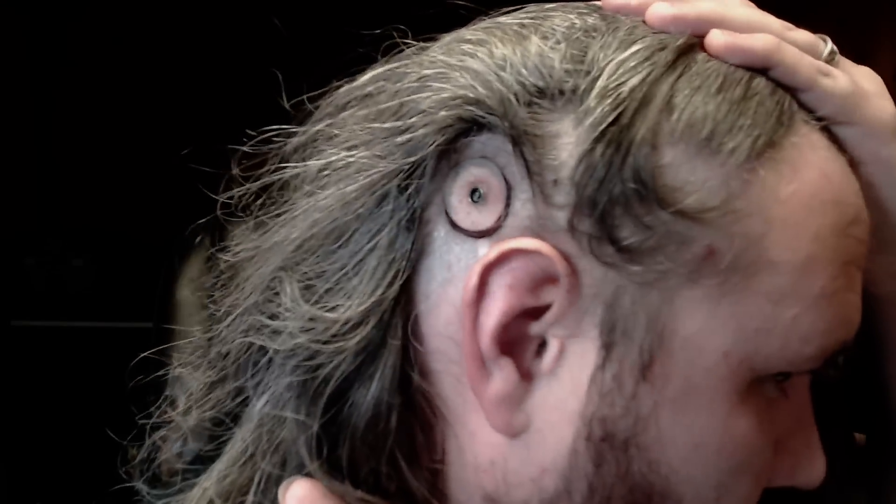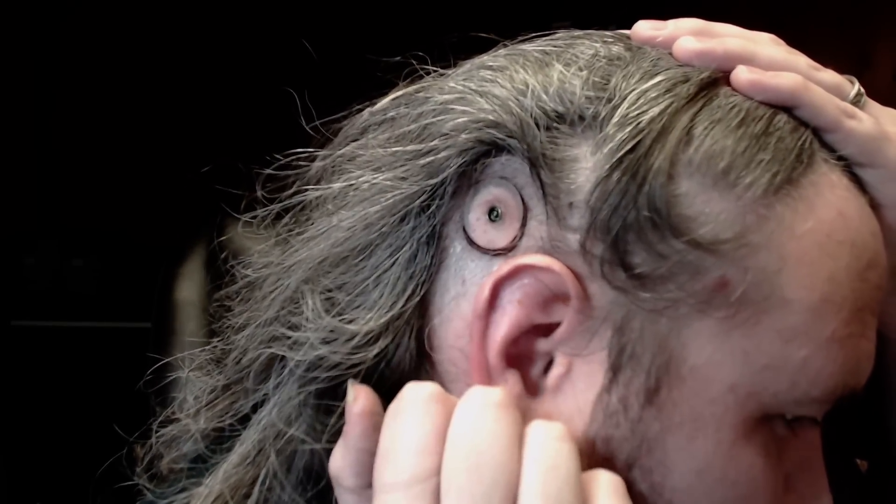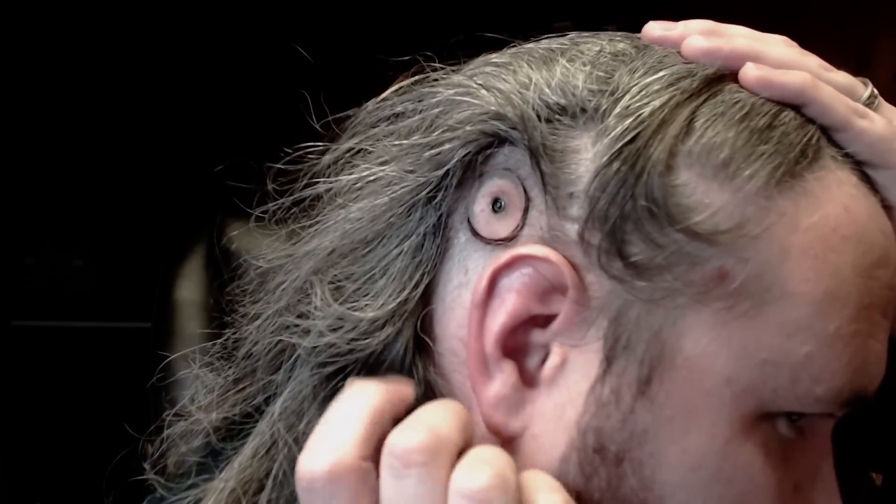Hey, I heard you guys were not squeamish, which is very good because I want to show you something. Here it is — it is my implant. I'm back from the world of the dead and I have joined the Borg. This is it in all its glory: the implant for my bone anchored hearing aids. I wanted to show this to you, talk a little bit about the surgery, and even show you the device.